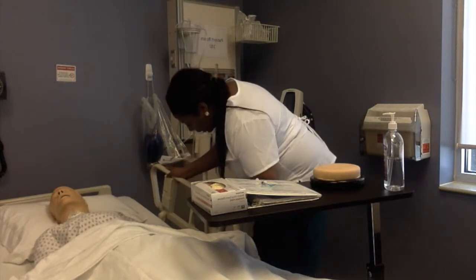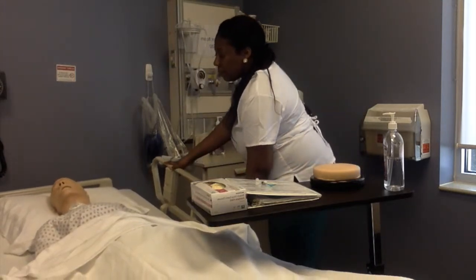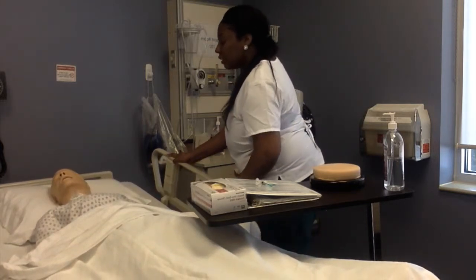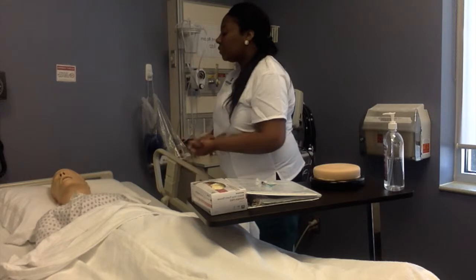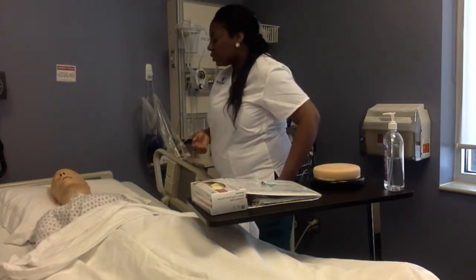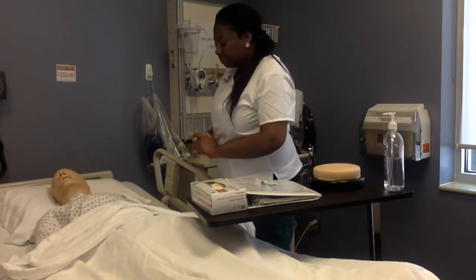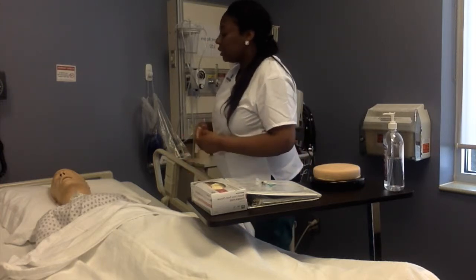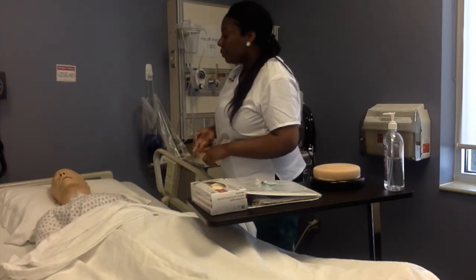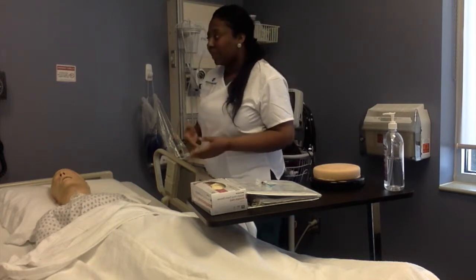Okay. Now I want to make sure to get the patient's bed into a working position. There we go. All right, Mrs. Jones. So today I am going to give you an intramuscular injection in your ventral gluteal site, which is the right, the side of your hip. And before I can do that, I do need to do some assessments. So I need to check your respiration rates, your blood pressure, your temp, and your pulse before we can begin.